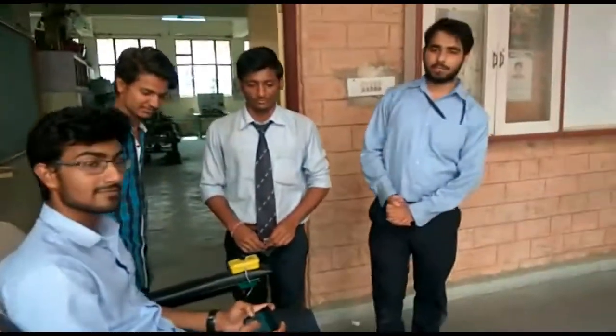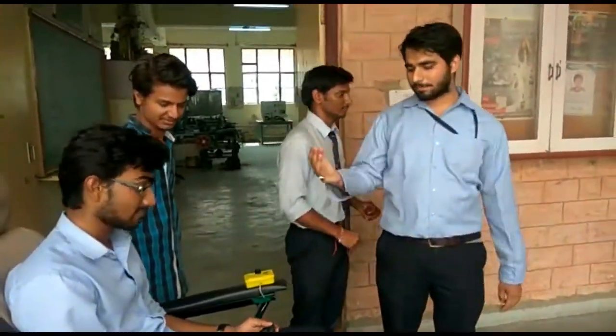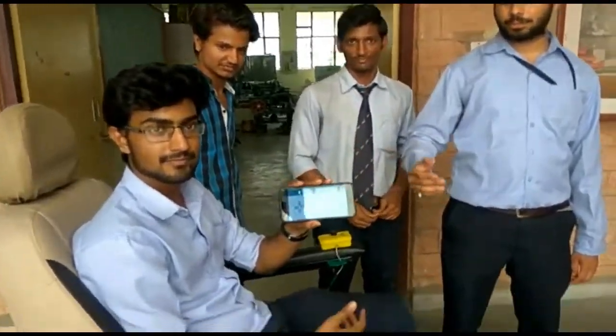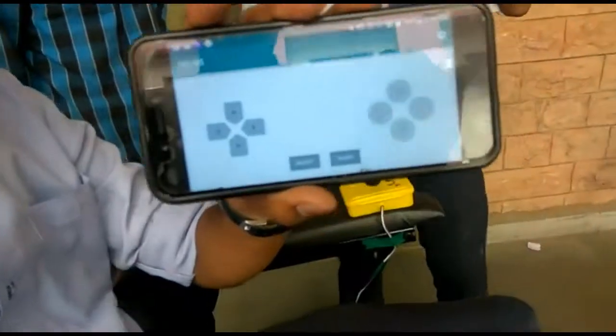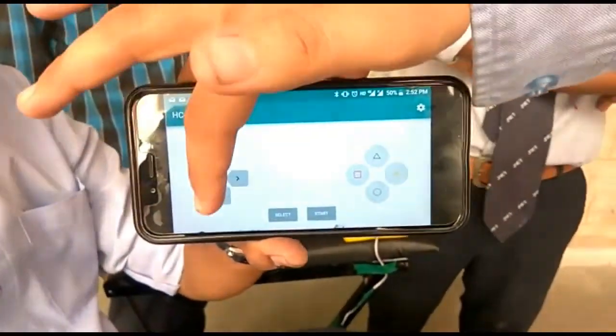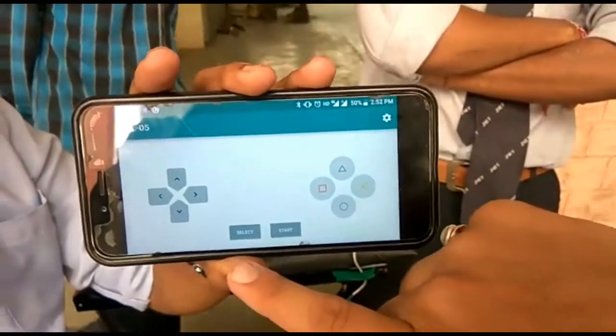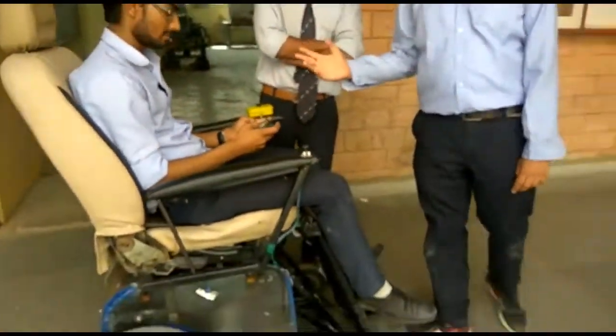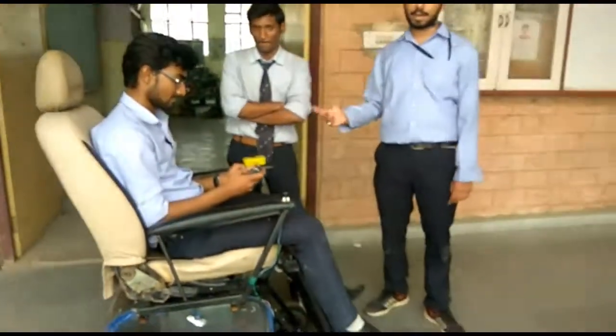Today I'm going to describe our wheelchair. First, I'm going to describe how it is controlled from Bluetooth. Here, this is the controller board on Bluetooth — this is for forward, backward, left, right, and this is for stop. Now I will show you how to control and run the wheelchair.